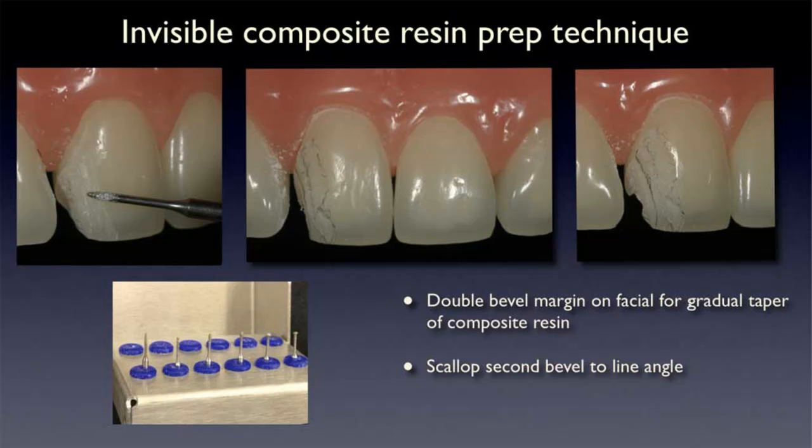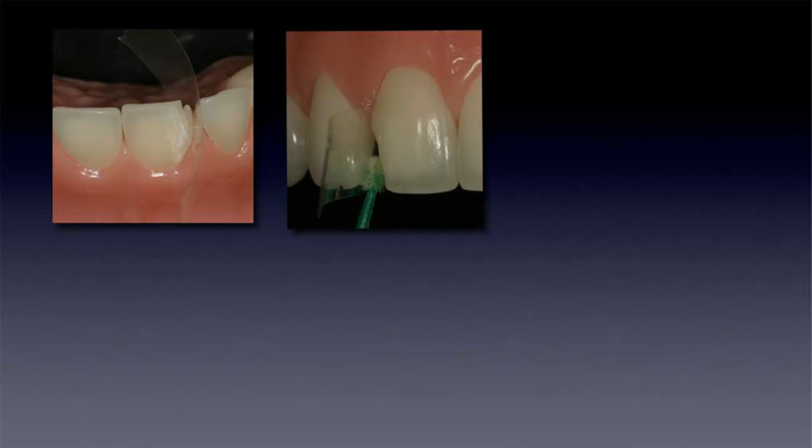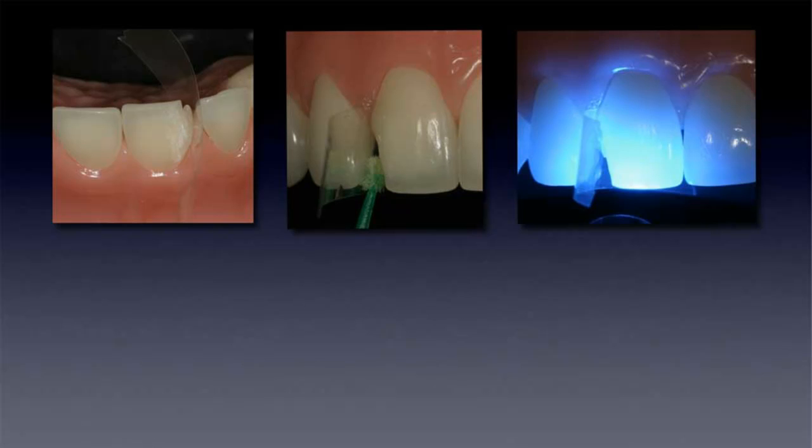And now I'm going to build this lingual shelf here, and I'm going to sculpt it into the tooth structure, and I'm using an A1 color in order for me to create this type of effect. And take a look at this here. Looks just like that.